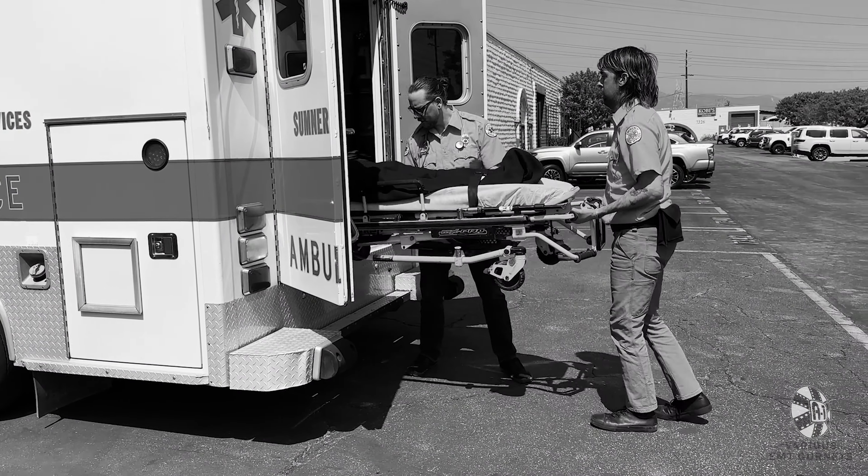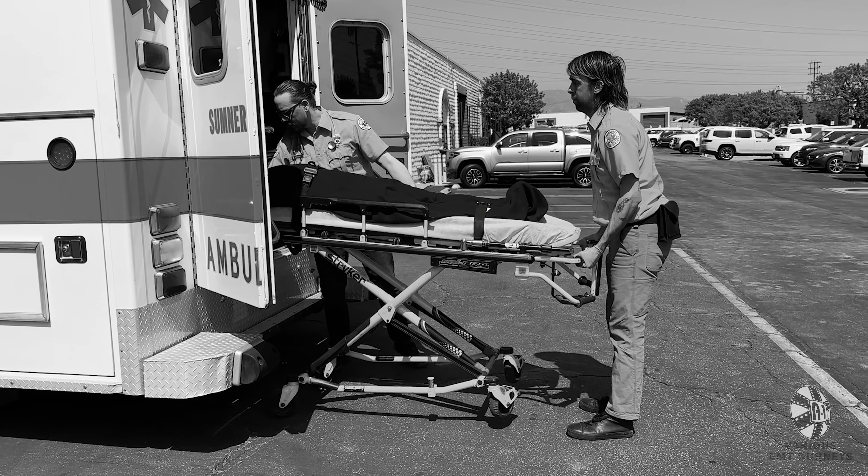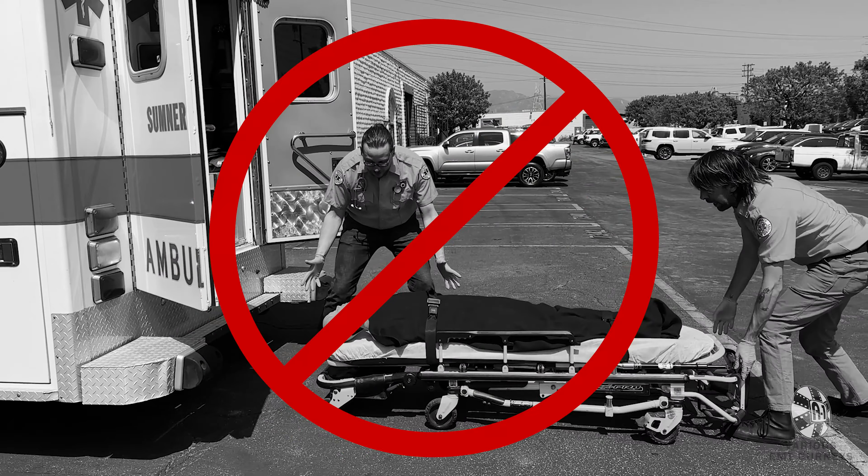Do not pull the gurney all the way out if you are holding the lever. Release the lever or the undercarriage won't lock.